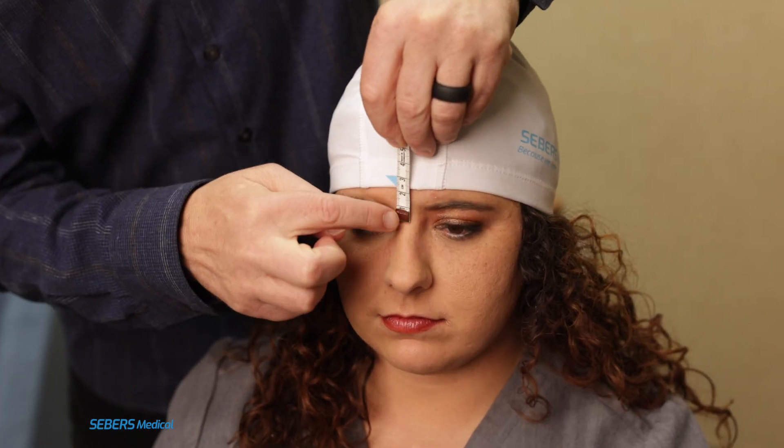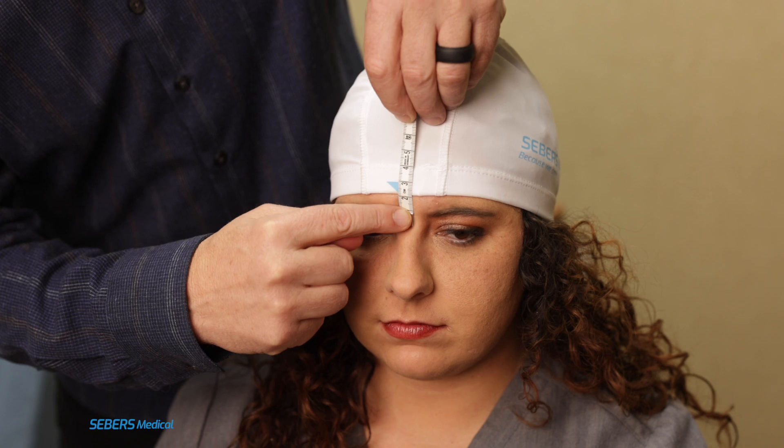Measure 2 cm from the nasion to the bottom of the cap to secure the correct forward and back placement.